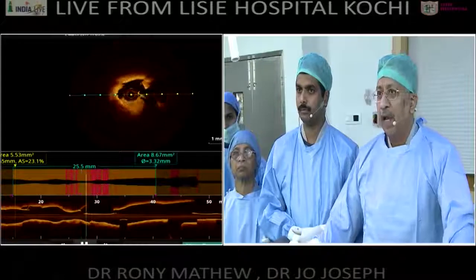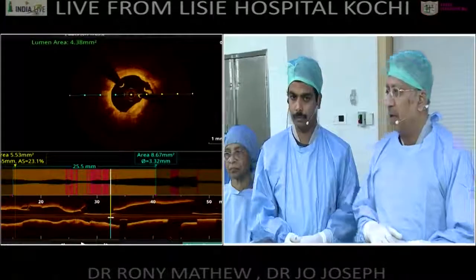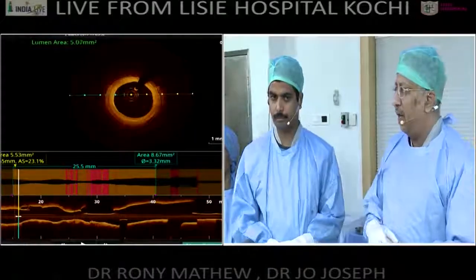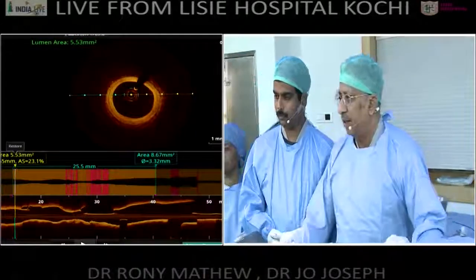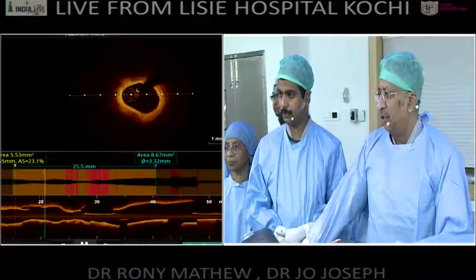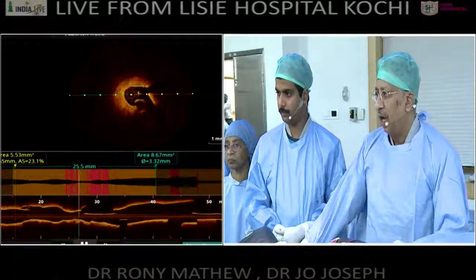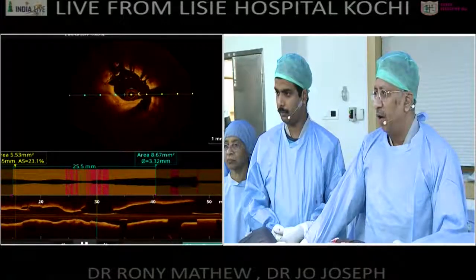Now, can you switch over to the OCT? If you look at the OCT, and I run the OCT, you can see there is a huge dissection over there. That's because of balloon dilatation, as we saw. And it is generally all lipid.